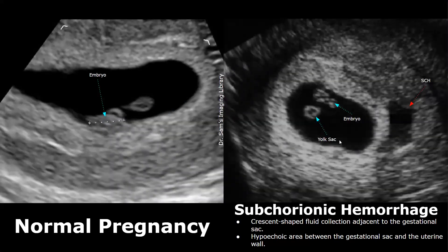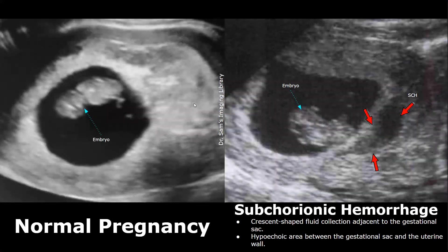This is another case of a subchorionic hemorrhage. A hypoechoic fluid collection is seen next to the gestational sac in early pregnancy. In a normal pregnancy, no such hypoechoic fluid collection is seen next to the gestational sac. This image also shows a hypoechoic fluid collection next to the gestational sac indicating a subchorionic hemorrhage.